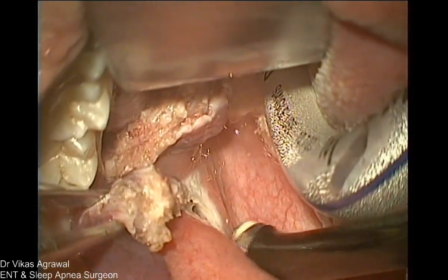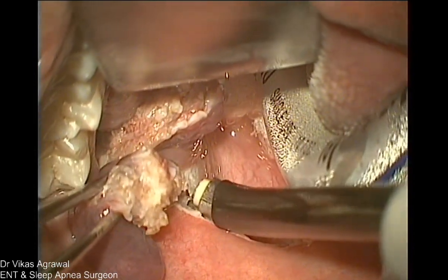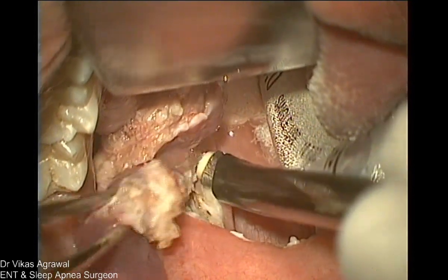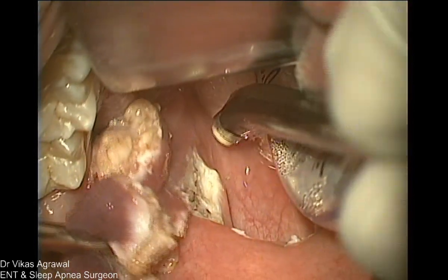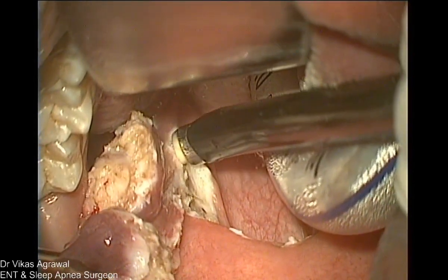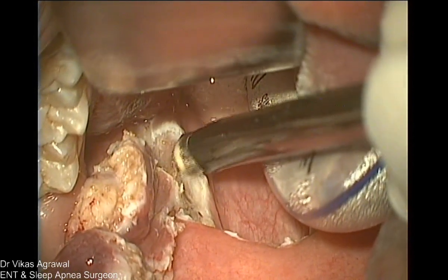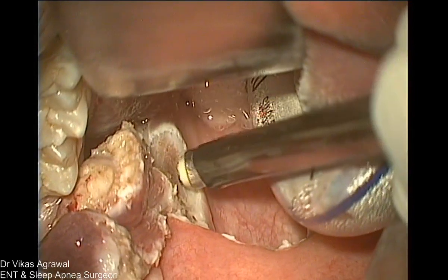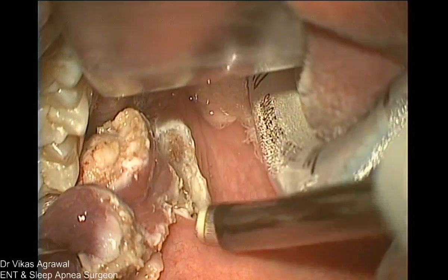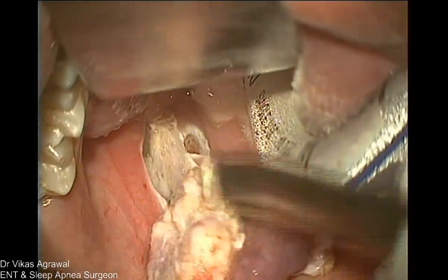So either you suture, and when you take sutures, you suture it like this, correct, Rahul? Yeah. I'm not doing any suturing, because sutures in my hands create more problems. They sometimes open up, they sometimes bleed, because when you're suturing, you do not know which vessel you are actually suturing into, and then when the patient coughs, they bleed. So I believe suturing doesn't do any great job. Now you see the oblique fibers which I'm cutting completely away. And in the next 2-3 minutes, the surgery on this side will be over.